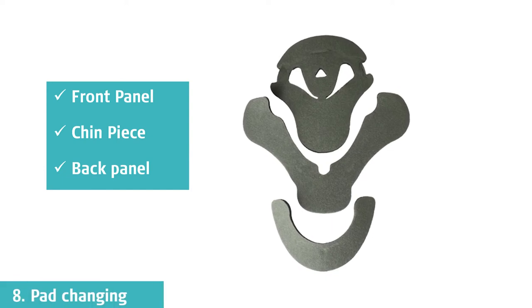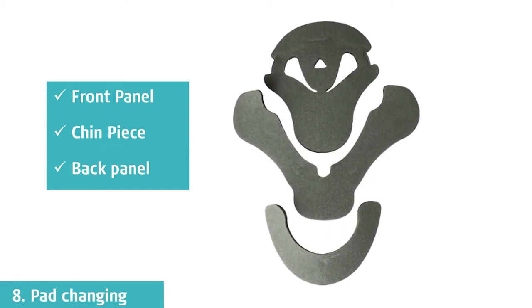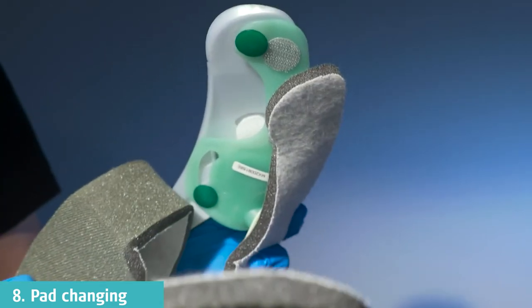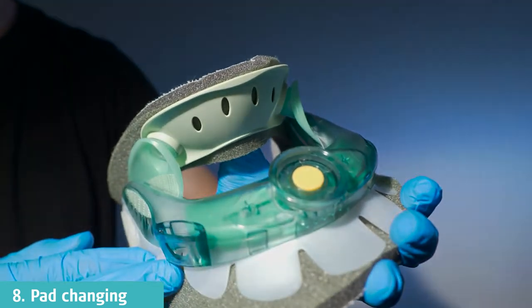There are pads for the front panel, chin piece, and back panel. The Vista pads can be removed when soiled and changed for a new clean set. To replace and adjust the pads, the grey-green colour material grips the Velcro dots. The pads must cover all edges of the plastic to avoid touching the skin.